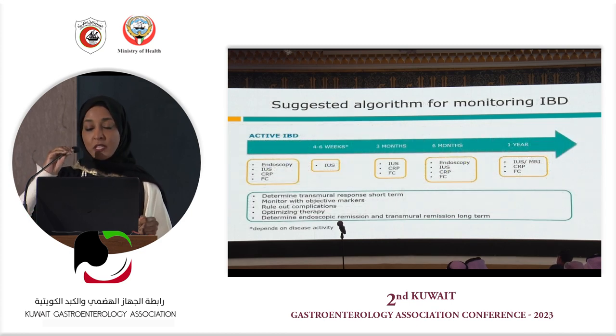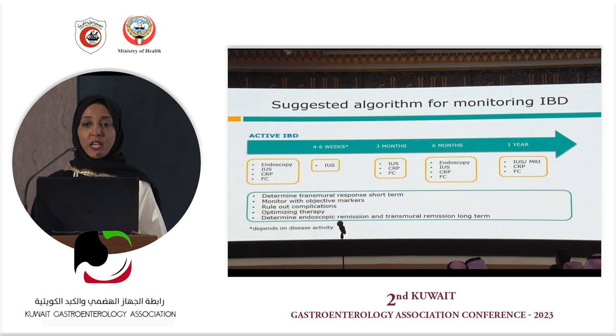At the end, what did I learn from using bowel ultrasound? Ideally, we have to follow the treat-to-target approach. So at week 0, we have to identify the patient and investigate them thoroughly, including the ultrasound. After 4 to 6 weeks, we can just do a quick scan for 5 to 6 minutes. And at a 3-month interval, you have to do the ultrasound also, with the biomarkers to confirm the remission.